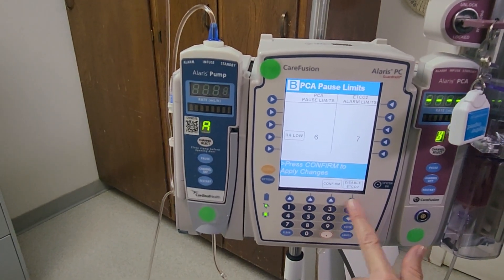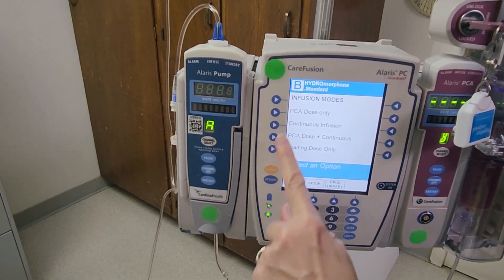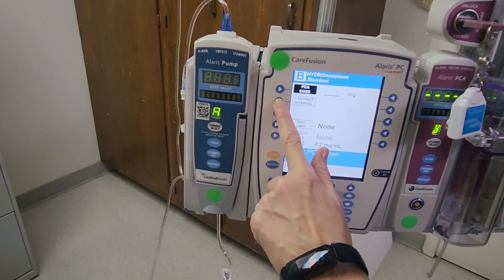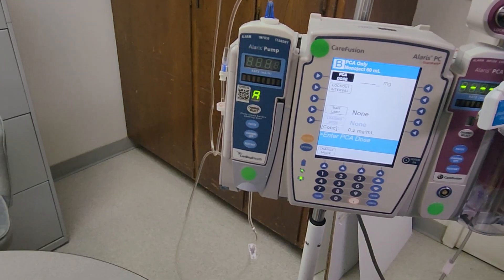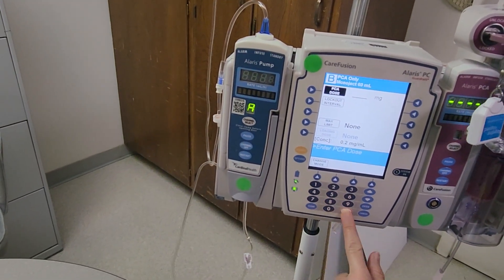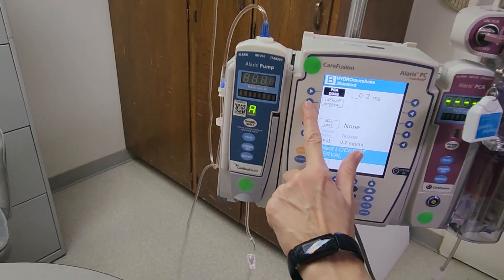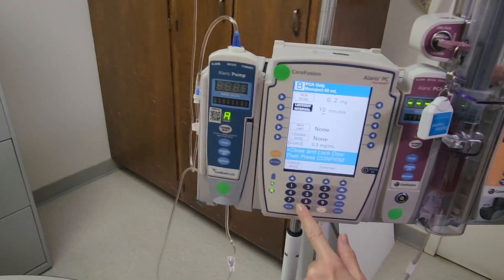You never want to disable the end tidal CO2. Hit confirm. Our order in this case is for PCA dose only, and the order says 0.2 milligrams. Then follow these buttons along the left hand side — our lockout interval in this case is 10 minutes.